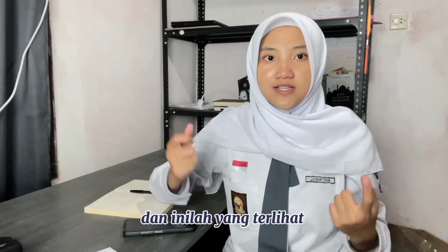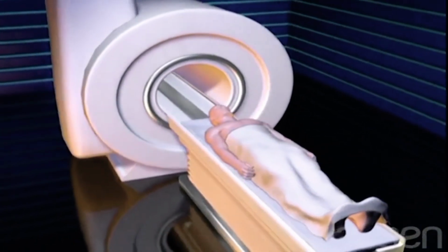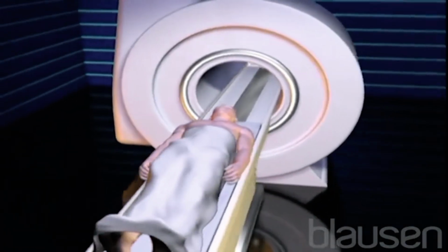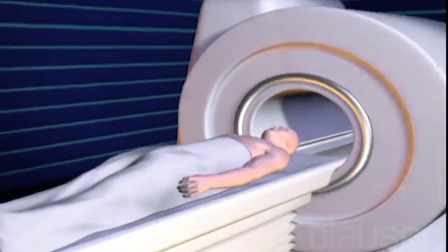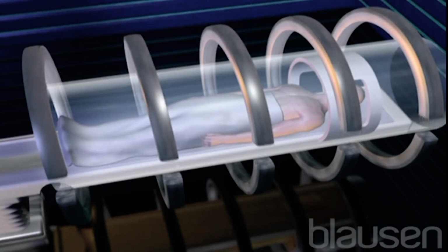And here is what it looks like when we do an MRI scan. Enjoy! When someone suffers from an internal ailment that cannot be detected by a traditional office examination, an MRI may be necessary. When an MRI is administered, the patient lies on a retractable platform which enters the center of the machine. Upon entering the machine, the patient is scanned by one of several magnetic coils.